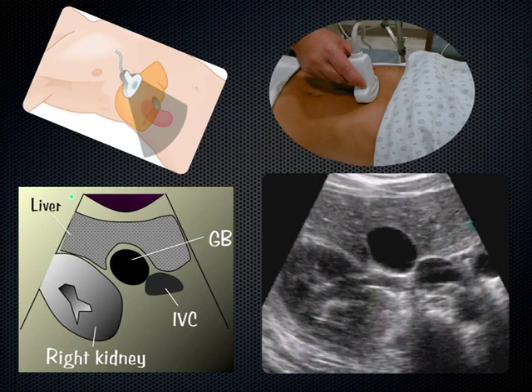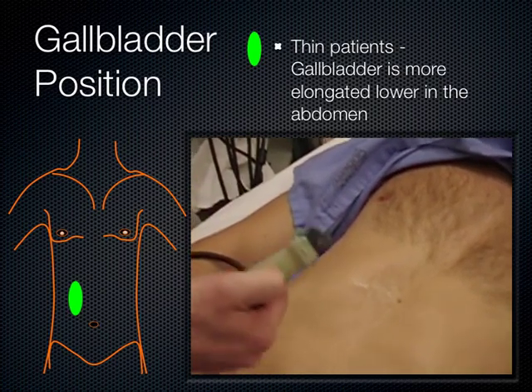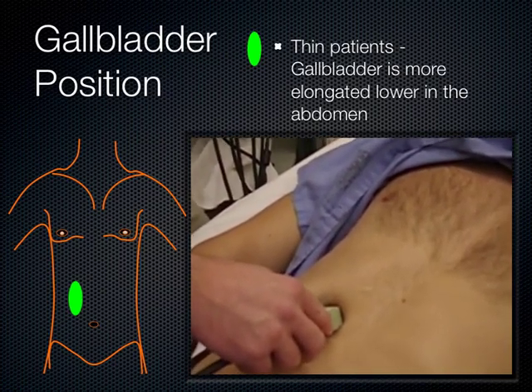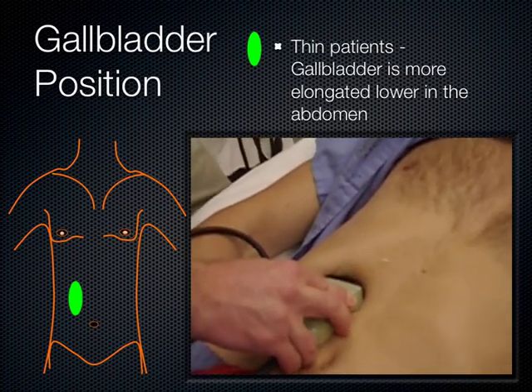And that's pretty much true. So when you're looking around the abdomen, when you find the closest thing to the skin that's anechoic, that's likely your gallbladder there. In young thin patients, we tend to find the gallbladder more lateral and anterior. In those patients, if you can't find it with the subcostal sweep or the X-7 approach, it's often helpful to take the indicator and really flatten it out against the abdomen.